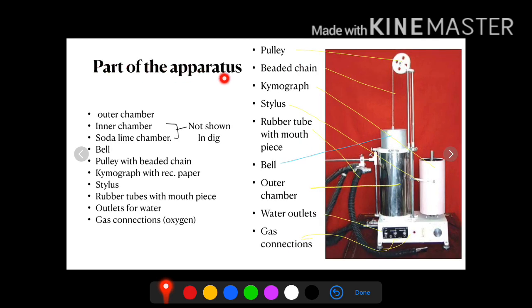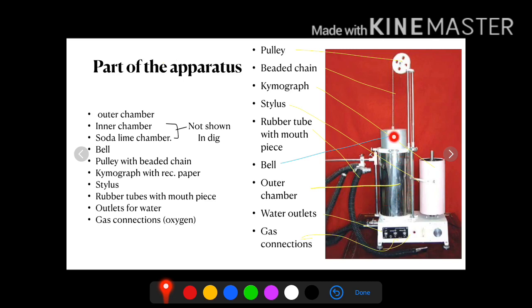Now what are the parts of the apparatus? There is an outer chamber, an inner chamber, and within the inner chamber there is a soda lime chamber. The soda lime chamber actually absorbs carbon dioxide. There is a bell which is an inverted chamber attached to a beaded chain that runs through a pulley. There is water between the inner chamber and the outer chamber, and the inverted bell is immersed within the water. There are corrugated rubber tubes with a mouthpiece, and there is a valve in the corrugated rubber tube which allows inspiration and expiration in separate directions.